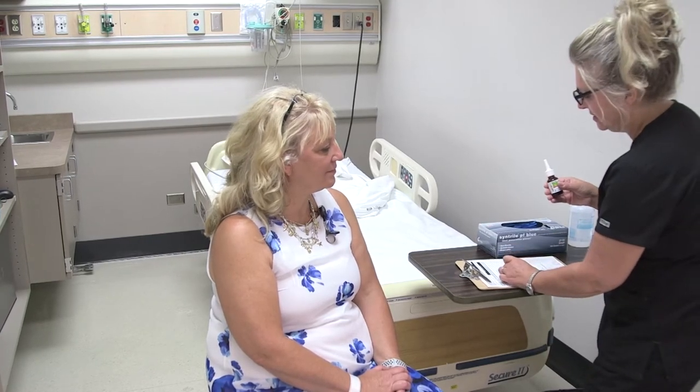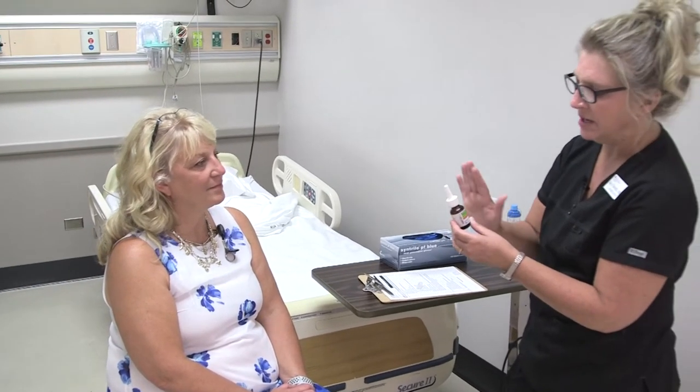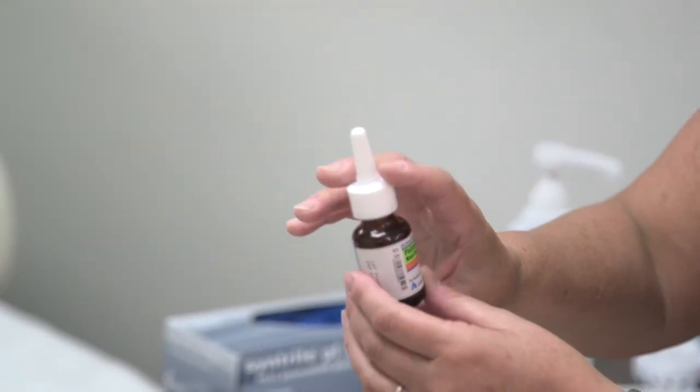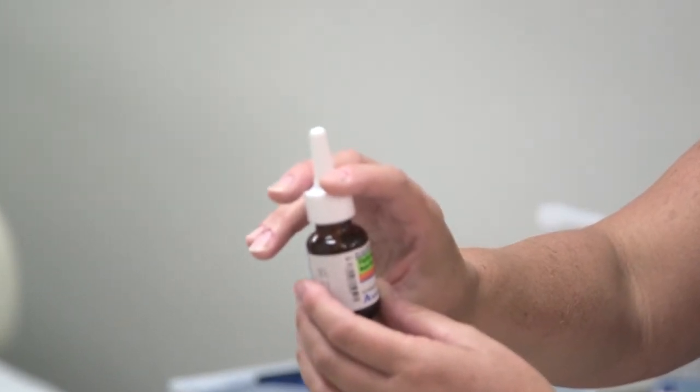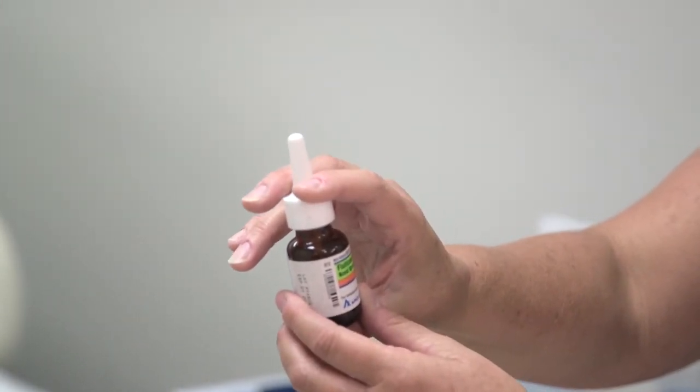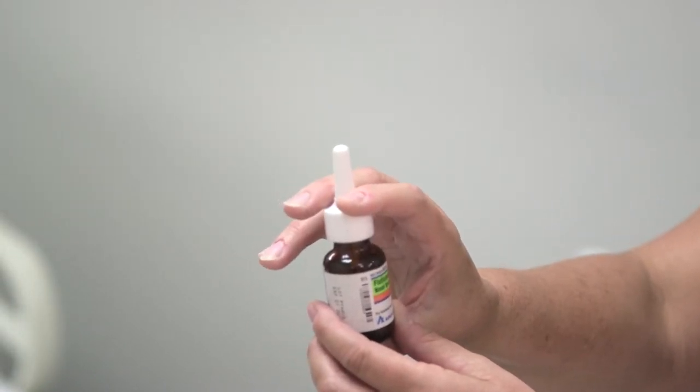I'm going to lay the inhaler on a clean surface and prime the medication to make sure it works before inserting it into your nares. I'll do a quick prime now — you can zoom in on that — works beautifully.